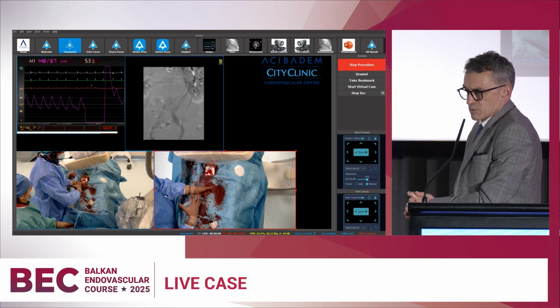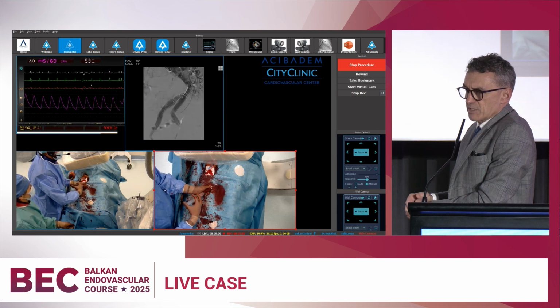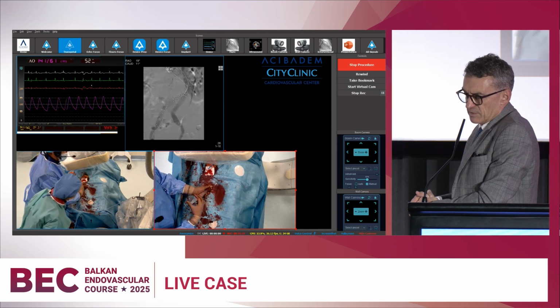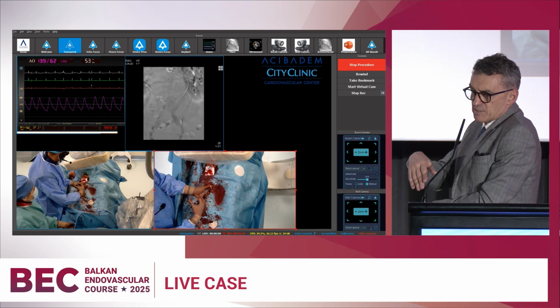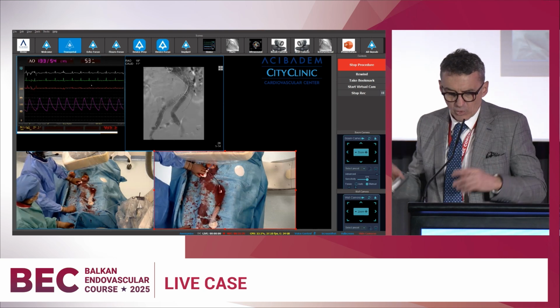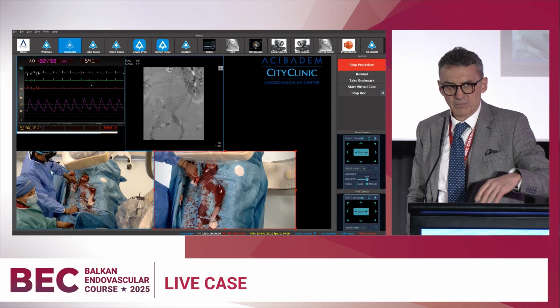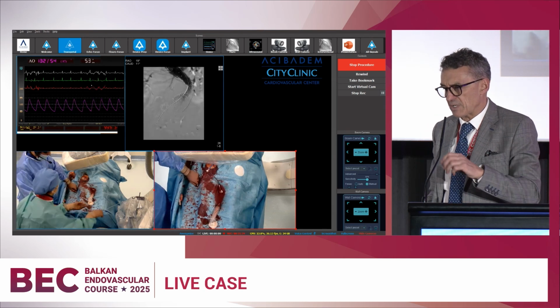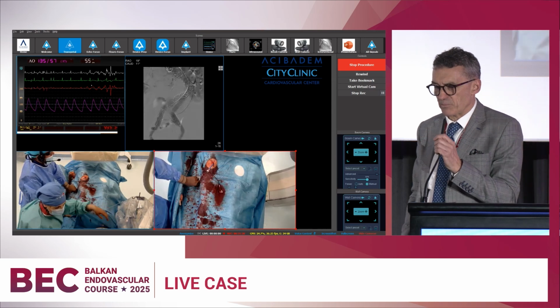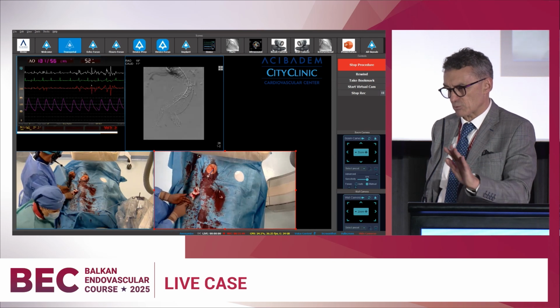Excellent, it's enough. So why am I asking him to wait? In order to see the late phase. In some cases, there is a late endoleak that can also be problematic. But in this case, even in the late phase, after the contrast disappears from the contralateral artery, there is no endoleak. So in the almost venous phase, no endoleak. It's the same as what our colleagues from the imaging department do during the examination of aneurysms, endoleak examination. Because of that, it's important to have the late phase, not just to see, but to wait.